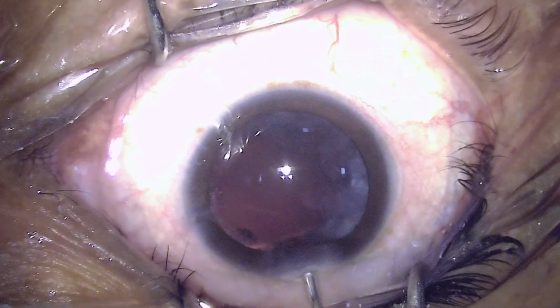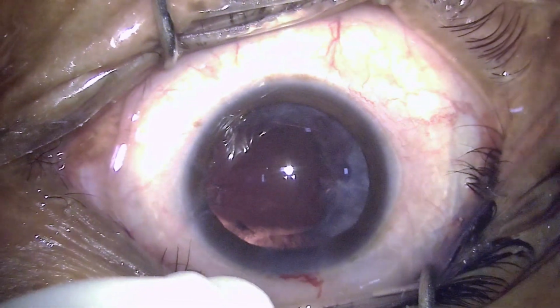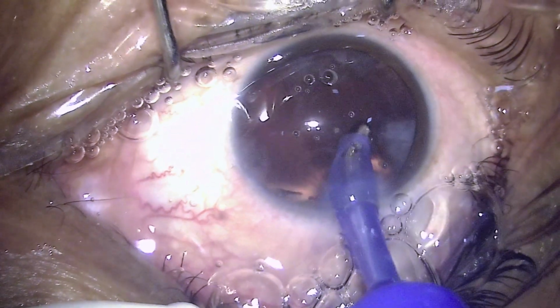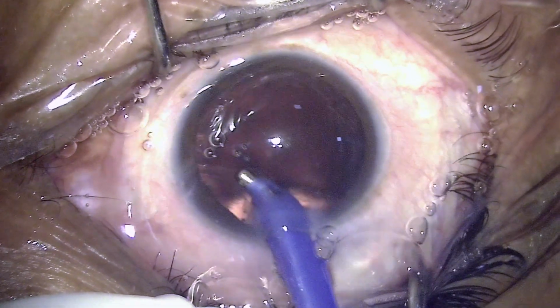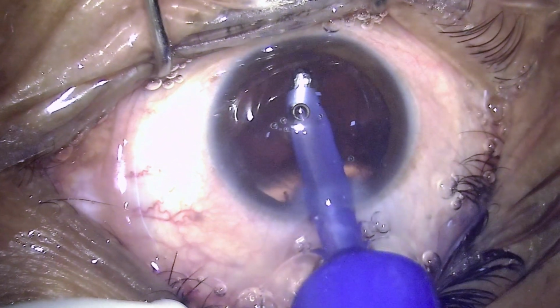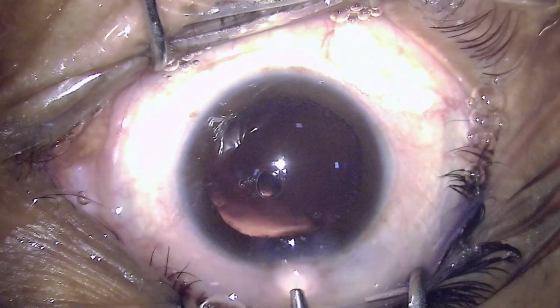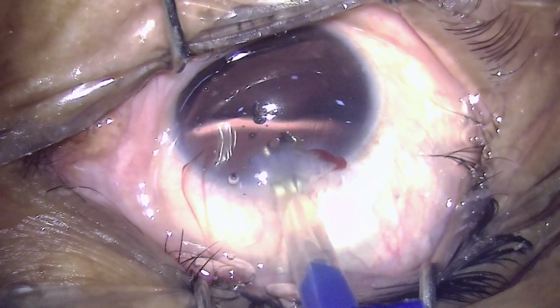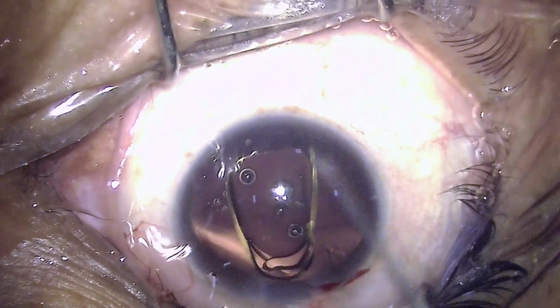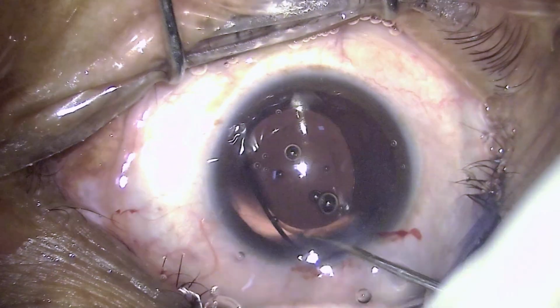The nucleus has been removed, and there is just a remaining opaque cortical fiber remaining, which is more like a flake rather than fibrous, and this also can be simply aspirated. Removing opaque lens fibers is relatively easy because they are easily visualized, and on the contrary, the fibers which are transparent need much more vigilant removal. And this is a hydrophobic multifocal IOL, which the leading haptic goes into the bag and the trailing haptic is simply dialed.